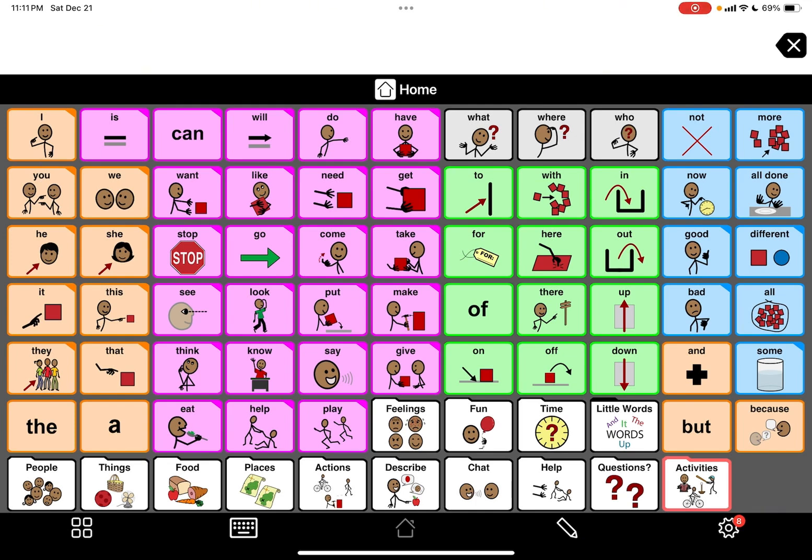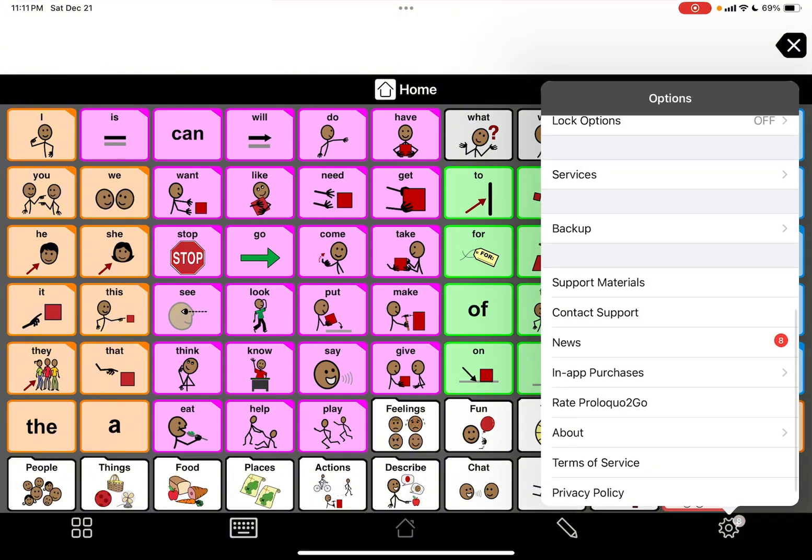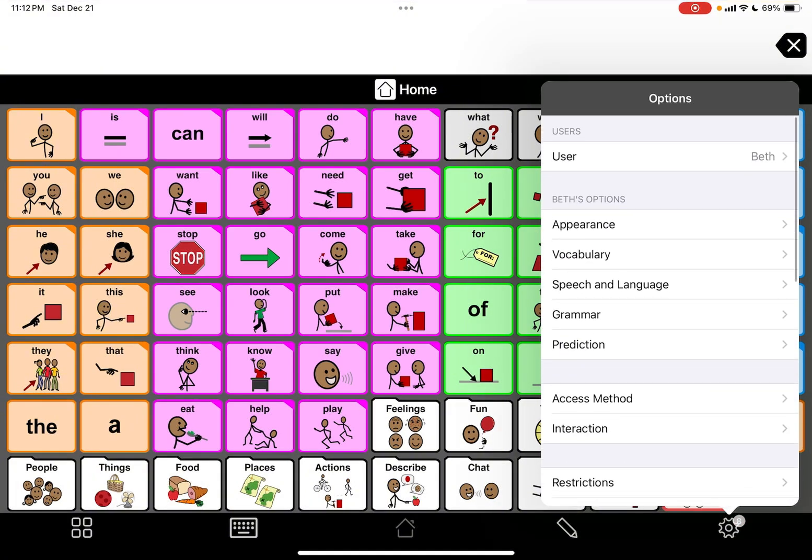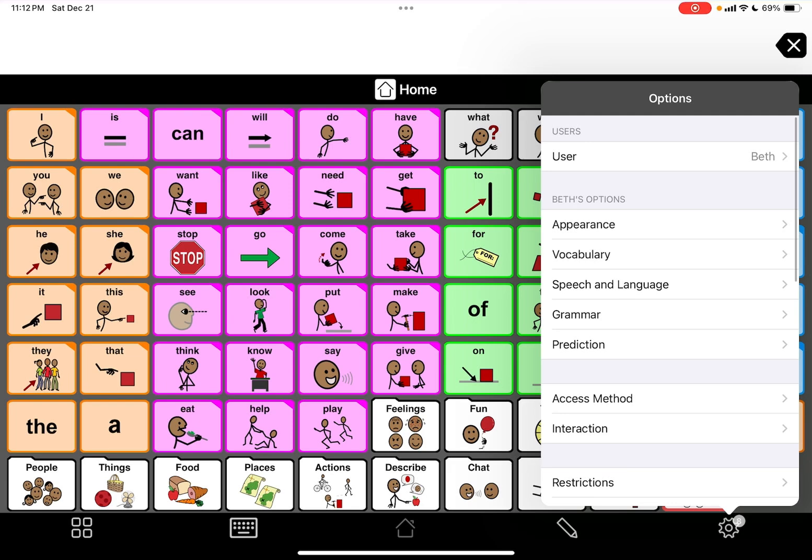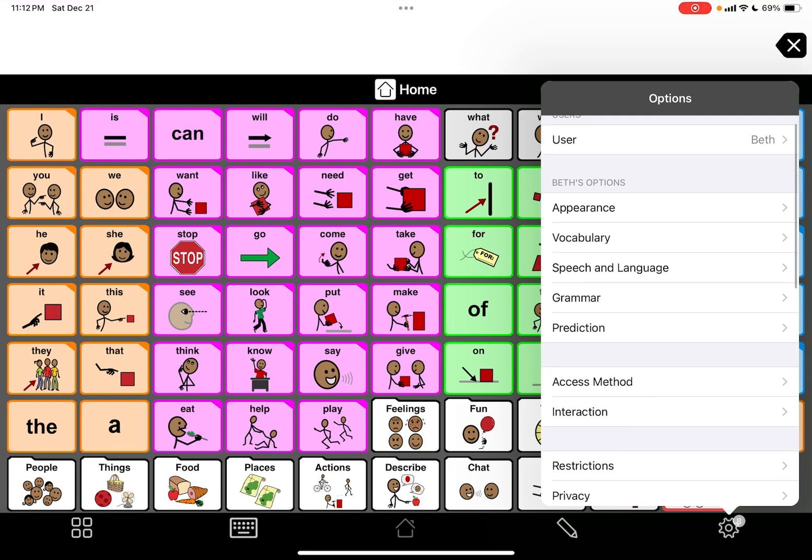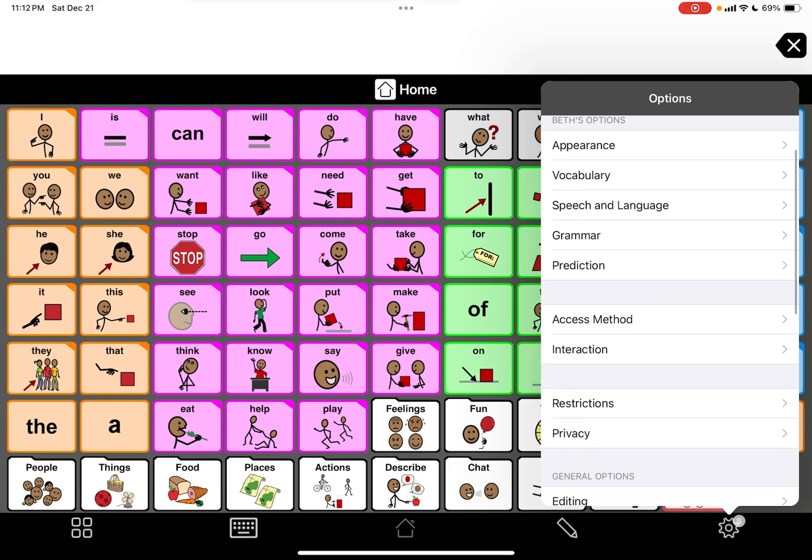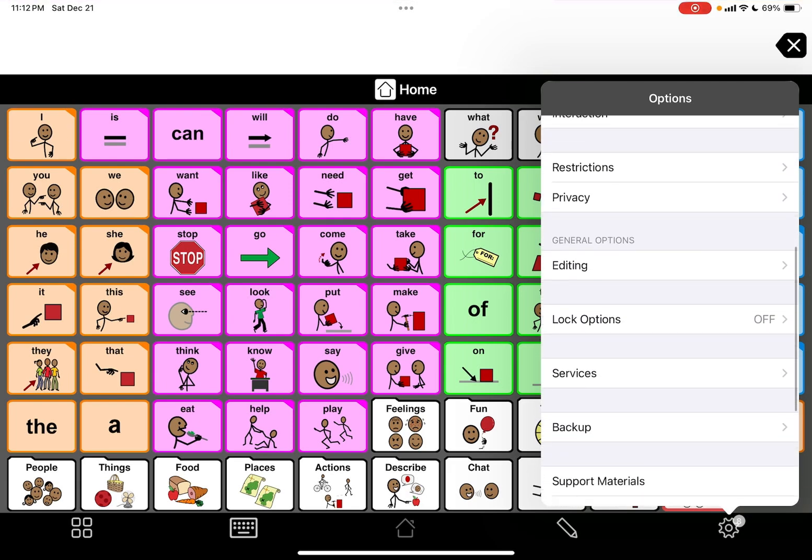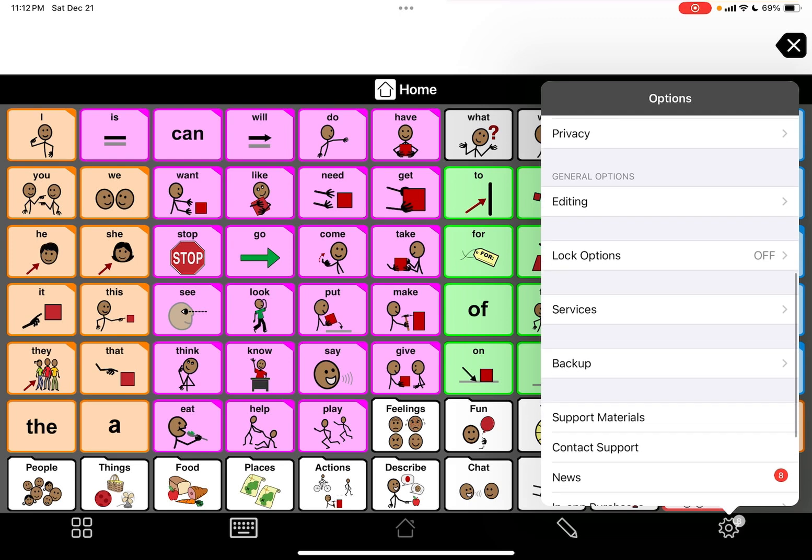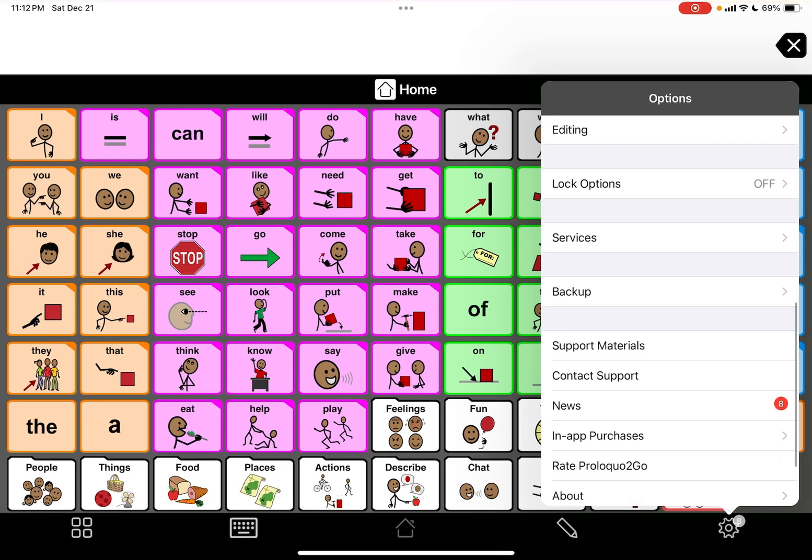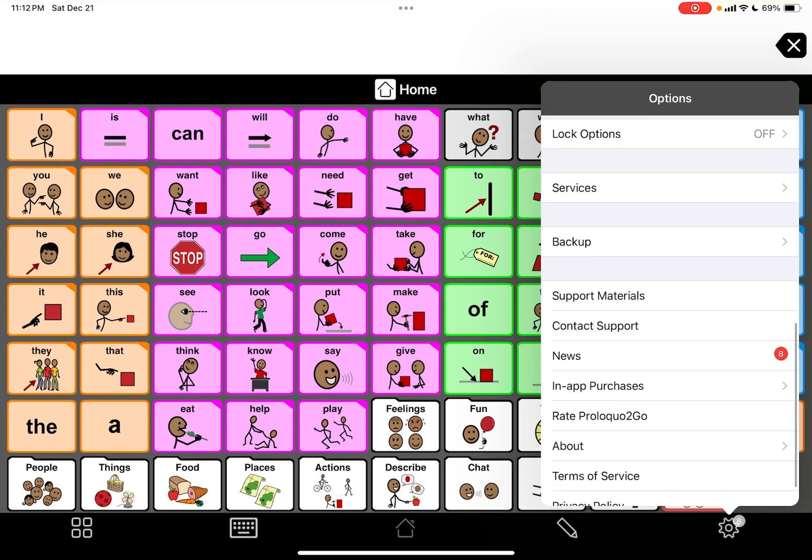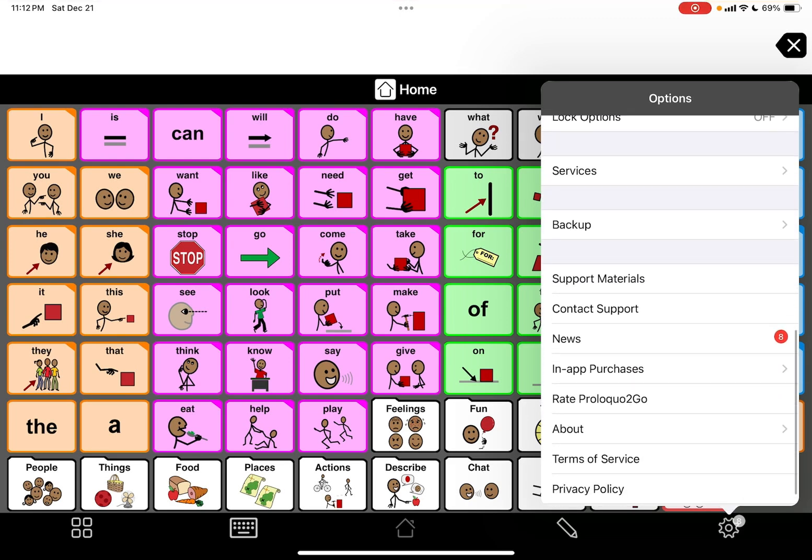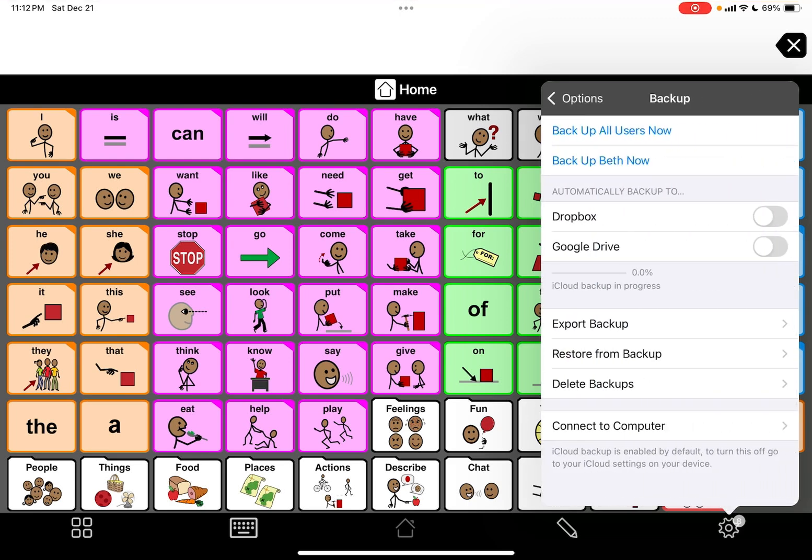I'm going to show you how to do that. You're going to go down to the right, the settings wheel. It says options and you can see this is user Beth, this is mine. So if you scroll down here until you get to backup, you're going to click on backup.